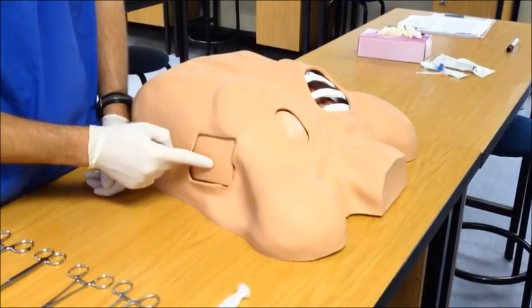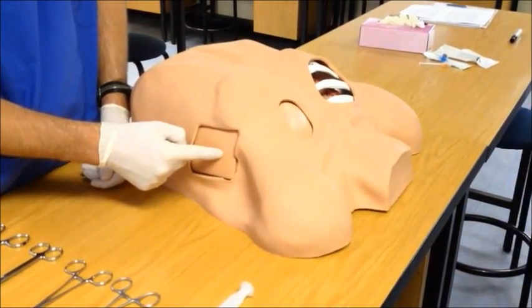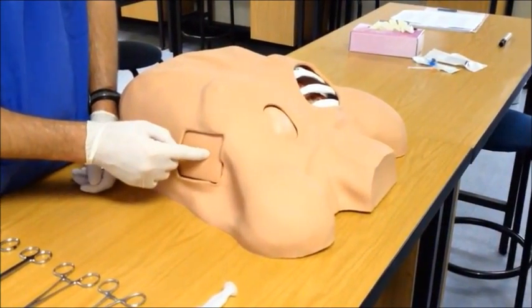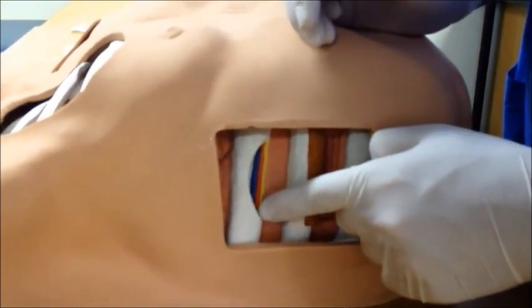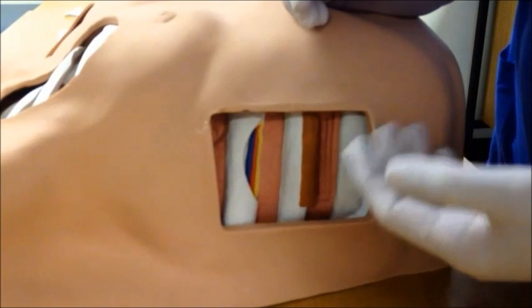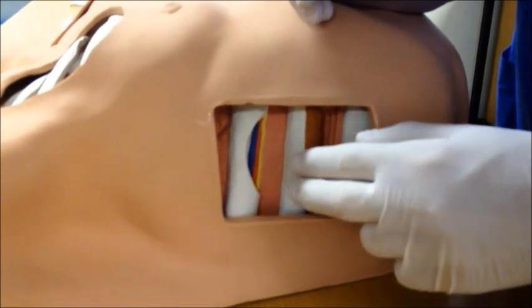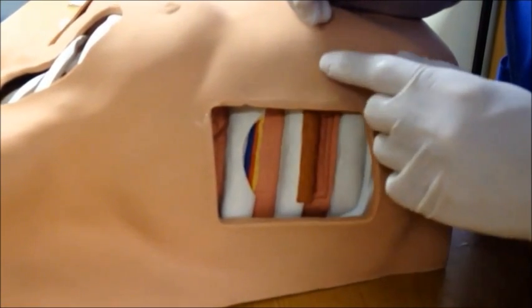Once the safe zone has been identified, palpate for the intercostal space and adjust your area of insertion to avoid excess soft tissue such as breast tissue in a female or a large pectoral muscle in a male. It is important when inserting the chest drain to avoid the neurovascular bundle. The intercostal neurovascular bundle runs on the inferior surface of each rib, and damaging it can result in excessive pain and blood loss. Make sure that you cut onto the top edge of the rib below and that your blunt dissection technique stays as close as possible to the top edge of the rib below.